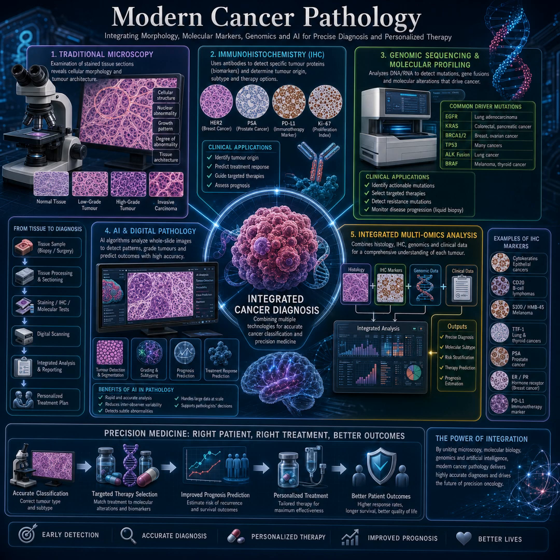Immunohistochemistry uses specially designed antibodies that bind to proteins produced by cancer cells. You can think of these proteins as molecular fingerprints that reveal the identity and behavior of the tumor. When an antibody binds to its target protein, a colored chemical reaction makes that protein visible under the microscope. Suddenly, the pathologist is no longer looking only at the shape of the cells. They are also seeing what those cells are expressing at the molecular level.